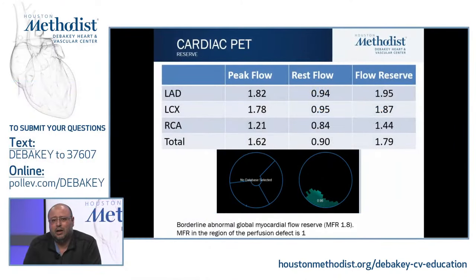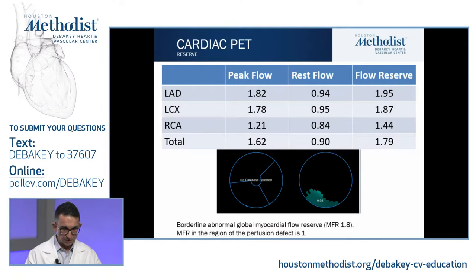And here you saw how it added diagnostic information, because now, even though I know that there is a lot of atherosclerosis in all vessels, now I can pinpoint the vessel that has the reduced perfusion and probably a stenotic lesion in it. Yeah, thank you very much. Yeah, exactly.